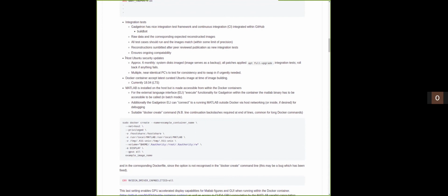We tend to freeze them every few months. We do the security patches and make images, some hopefully sensible IT administration. We then do the integration tests, and if anything's not succeeding, we can just roll back to the previous system.